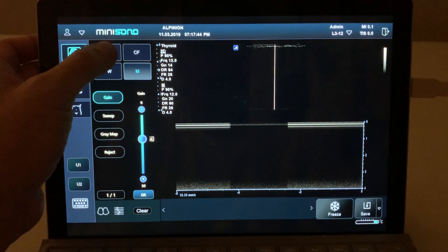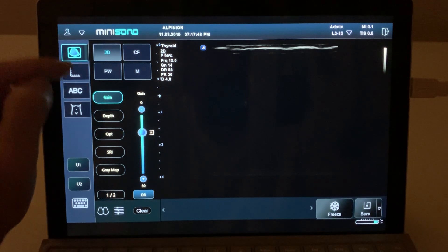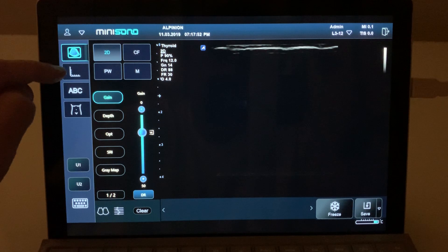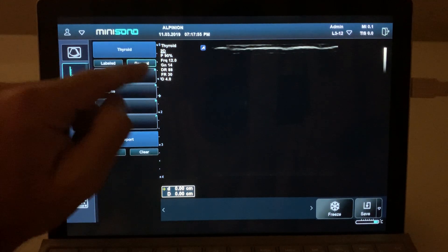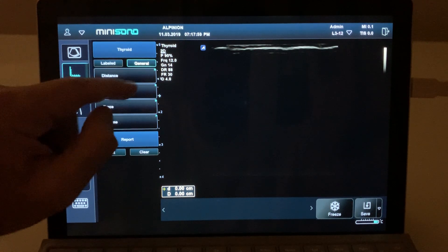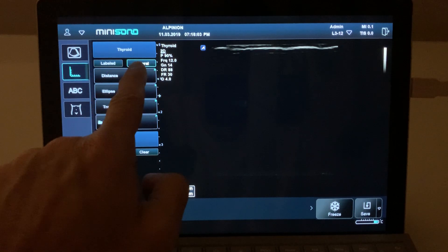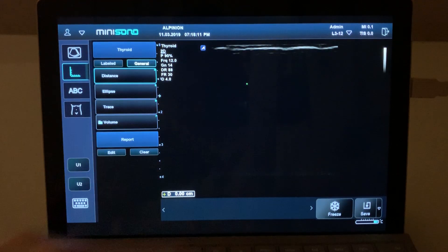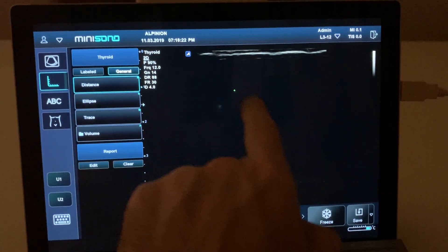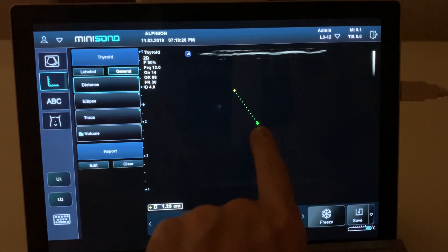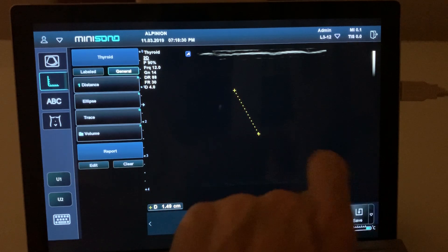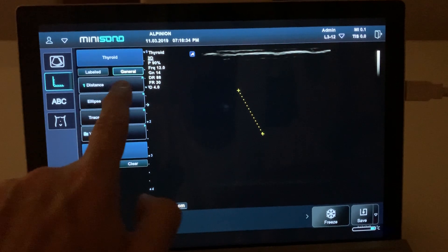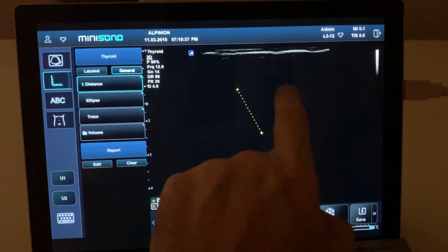If you want to do measurements, you see this little scale icon here. When you click there you will have a different menu for measurements. If you want to do a distance, click 'distance' and you'll see a caliper appear. You can either move the caliper with your finger or with the trackpad. When you want a second caliper, drag to wherever you want it. If you need another caliper, click 'distance' again and you have another caliper to move wherever you want.